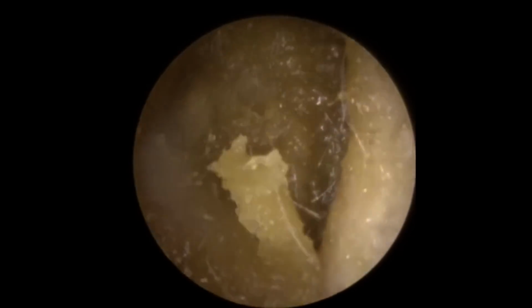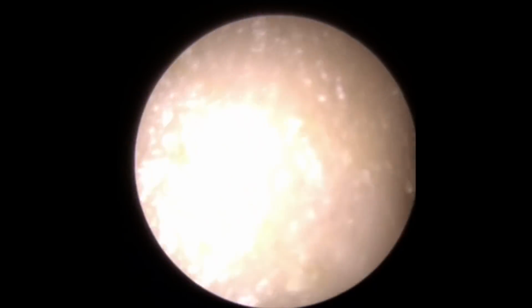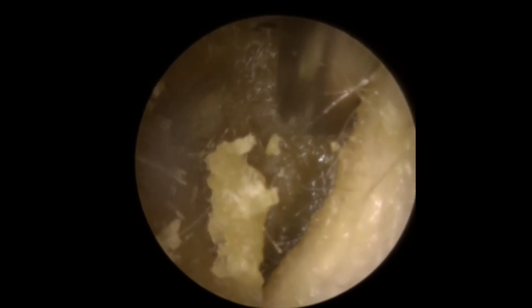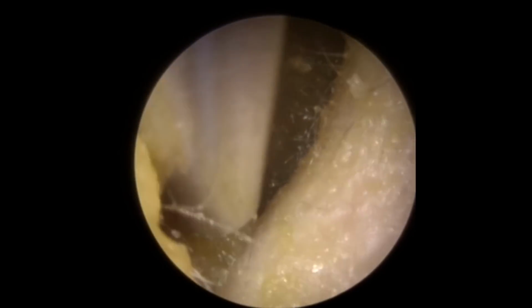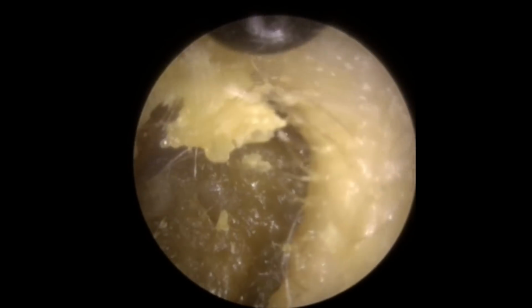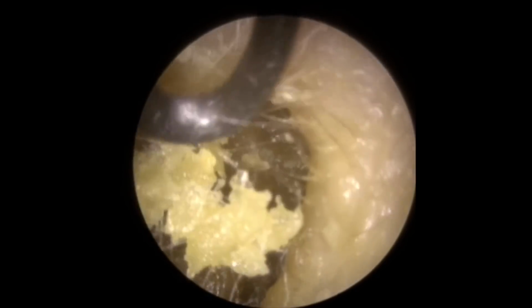Thank you very much for watching that earwax removal compilation video today. So we have two patients in this compilation. The first one here, very dry earwax, so quite hardened up. Patient was struggling a little bit with their hearing, but also with the sensation of feeling very full, pressure as well in this ear canal. So you can see we just tried to use the standard size Zollner tube there, but not really budging this wax at all, because it is very thick and quite tough stuff.